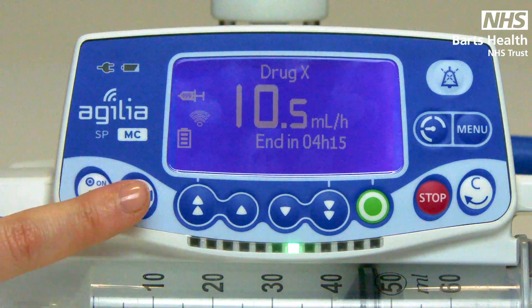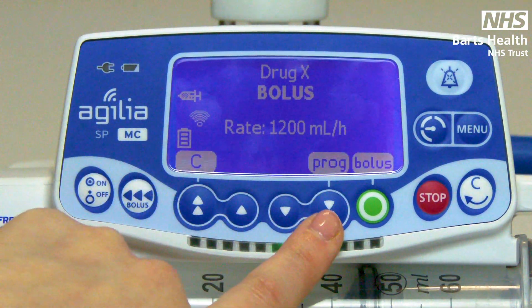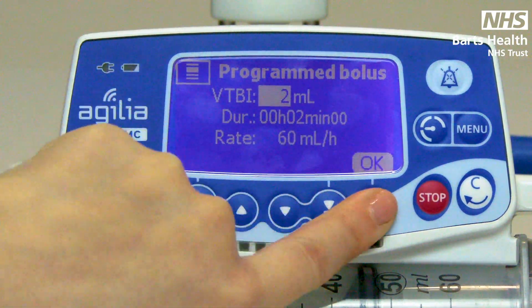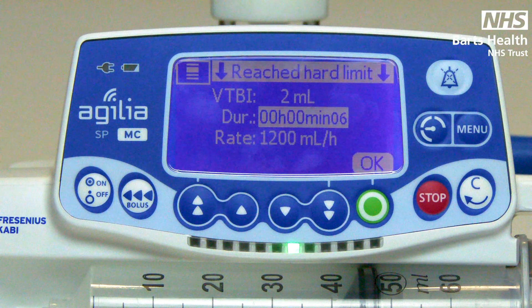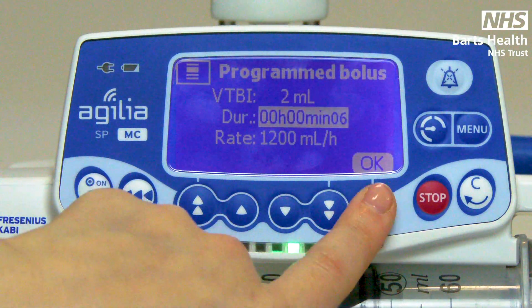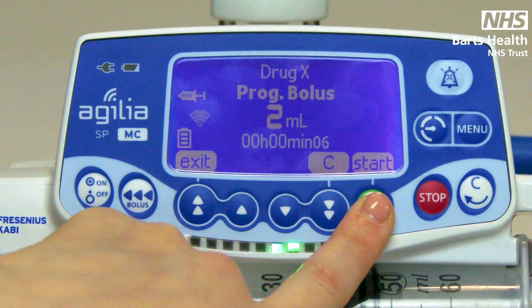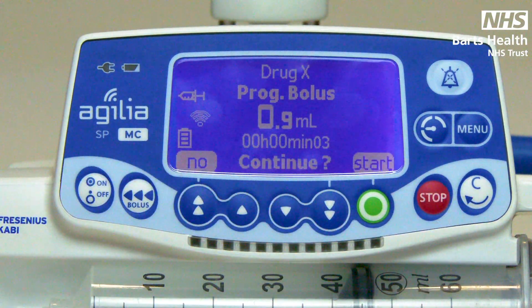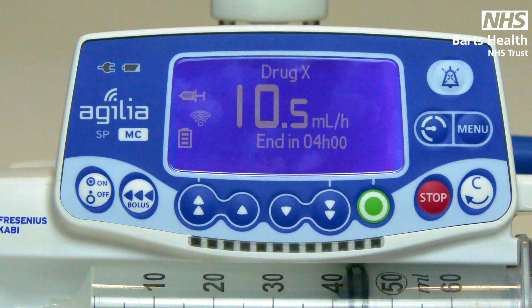The second method is program bolus. Press your bolus key once and press the soft key under prog. Here you can enter the volume of the bolus you want to give and how long you wish to give it over. The fastest the SP can go is 1200 mls per hour. Press OK to confirm and again press your green button to start. You can stop the bolus at any point, or if you let it run through, you will go back to your original infusion rate.